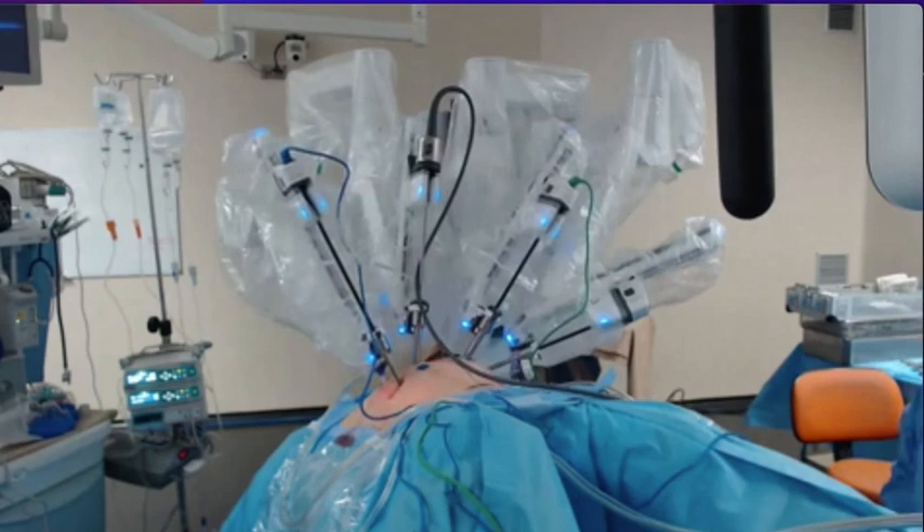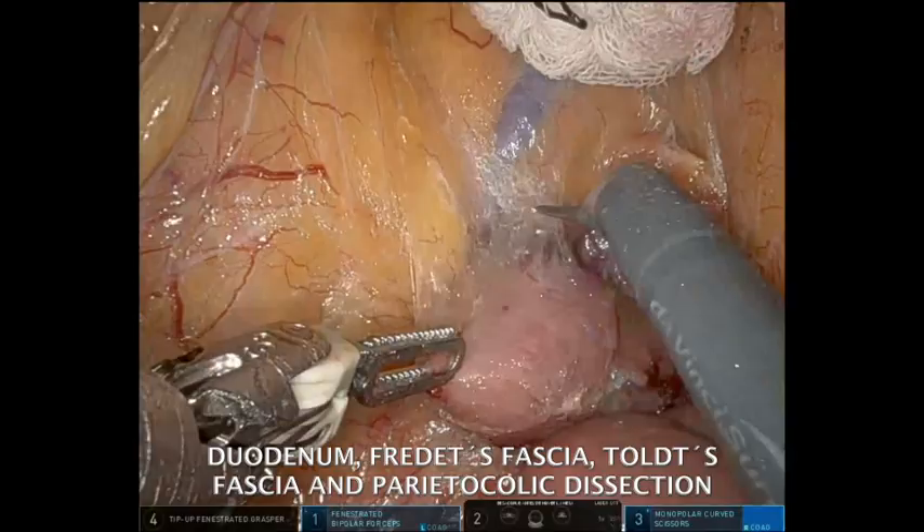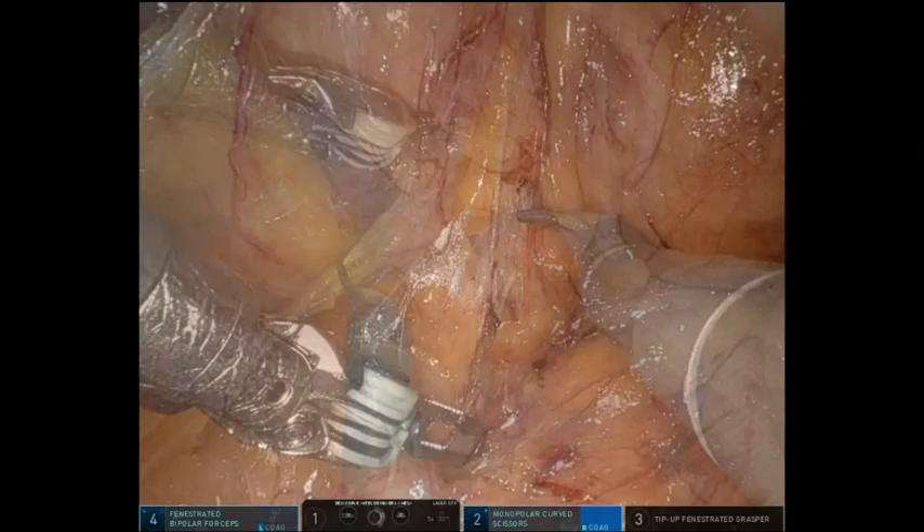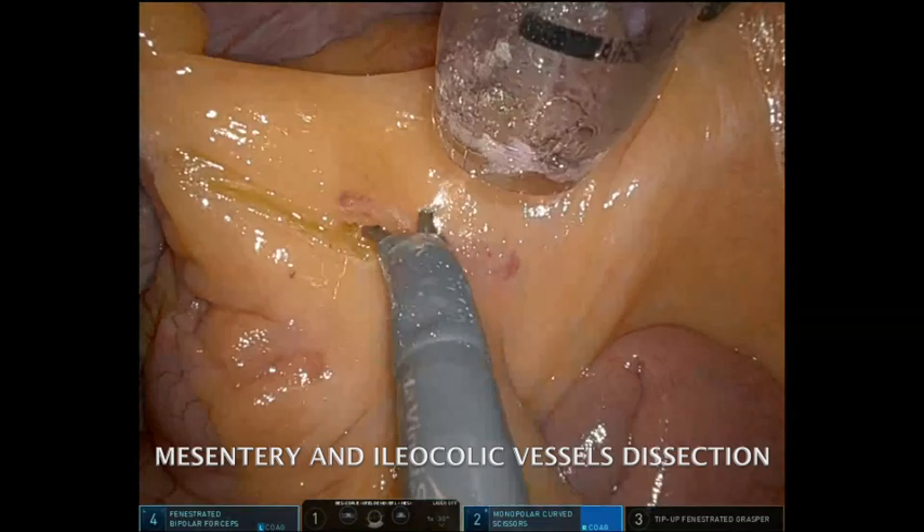Arm 4 bipolar, Arm 1 camera, Arm 2 monopolar, and Arm 3 tip-up. The right mesocolon is mobilised with an inferior approach. The first incision is made at the terminal ileum towards the duodenum, preserving the right ureter and gonadal vessels. Dissection of the pancreatic head is followed by that of the right mesocolon over Toldt's fascia. A gauze is placed over the head of the pancreas to avoid any injury during further dissection. The medial to lateral approach is then carried out to dissect iliocolic vessels, which are sectioned distally.